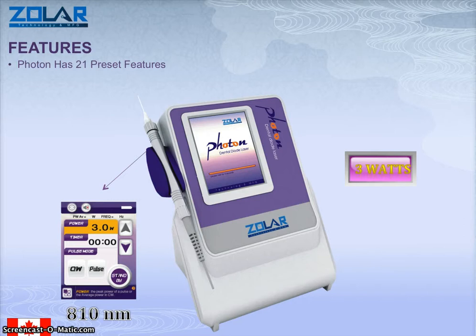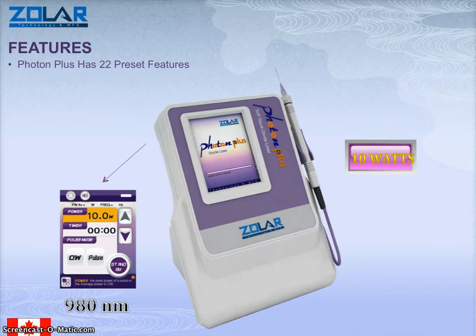The Photon has 21 preset features. This is a laser that has 810 nanometers in wavelength. It has a menu-driven screen. It's very easy to select the settings that you have, and it's got its own preset settings as well. It also comes in a 10 watt model which has 22 preset features and a 980 nanometer wavelength.